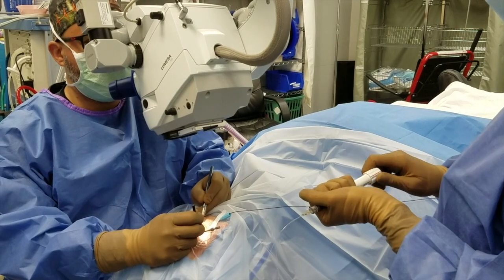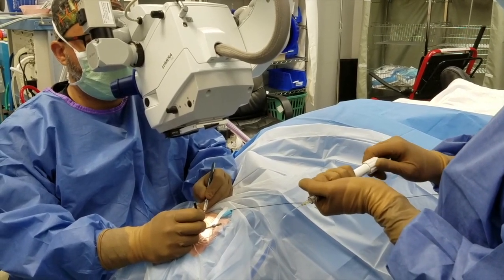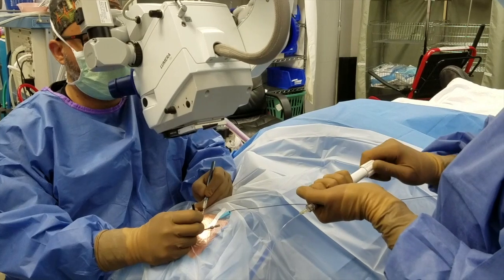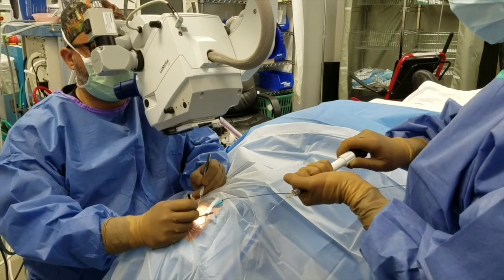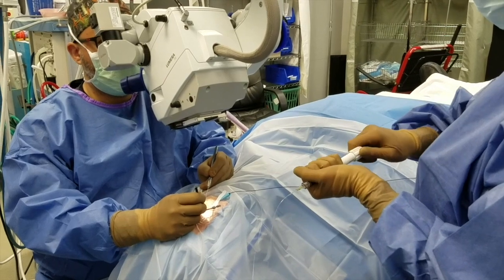Every time there's 1/8 of a revolution on that viscoelastic injector, it will express viscoelastic into Schlemm's canal, which is then forced anteriorly through the TM and posteriorly through Schlemm's canal and into the collector channel. With one continuous smooth motion. Excellent.